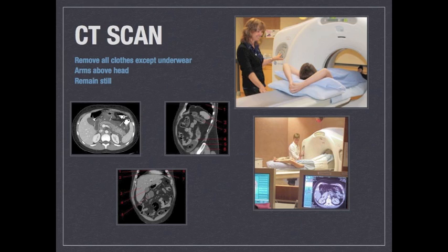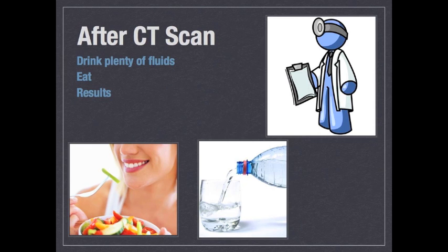It is important to ask the patient to remain still in order to ensure good quality images. Sometimes you will need to ask the patient to hold their breath in for a short period of time. Once the procedure comes to an end, we instruct the patient to drink plenty of fluids to help eliminate the contrast of the body. Also, he or she will be starving, so inform them they can now eat. The patient will then wait for his or her results.